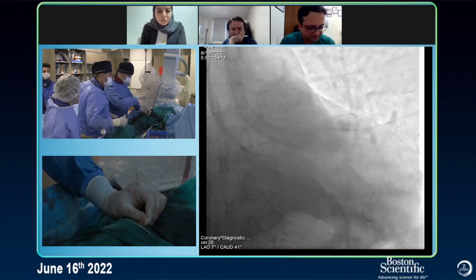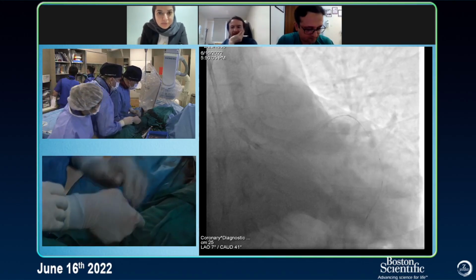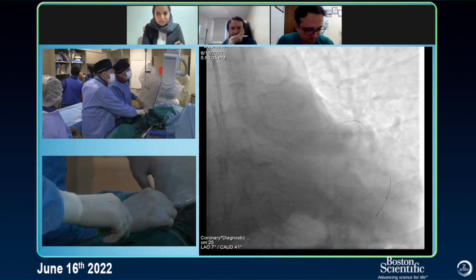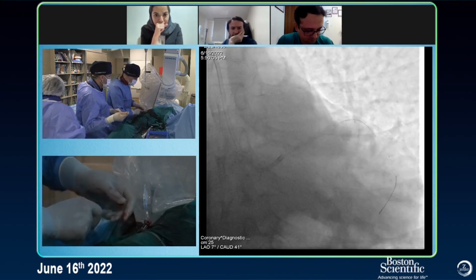Not sure if we can extend this a few more minutes. If we can't, it would be great to see an IVUS to see how. If you give me 15 minutes, I can show everything. 15 minutes, I think from now would be enough.